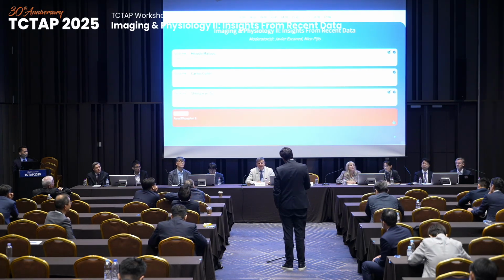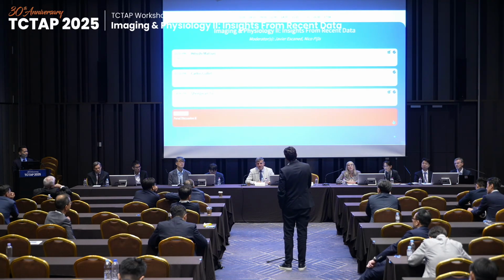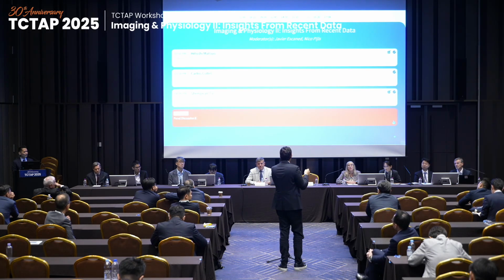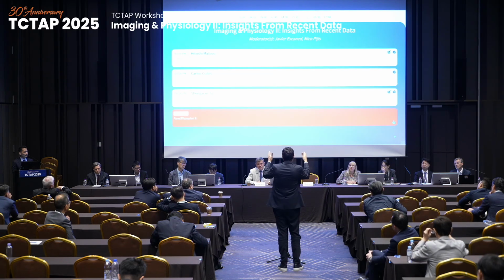Yeah, so the instructions is you start with an FFR measurement. When you reach a stable hyperemia, you start, I'm going to describe the process, Nico. So you are in the distal part of the vessel, then you start recording the pressure, and then you start pulling back the wire. What is important is not to stop. You have to pull back continuously, steady at the same speed, not too fast, not too slow. And then when the sensor reaches the guide, you just click stop, and then you have a beautiful pullback.